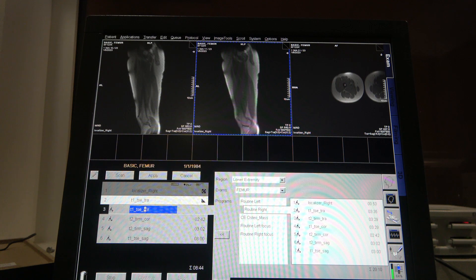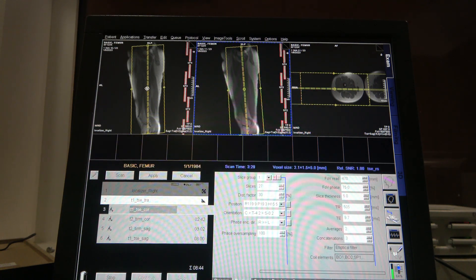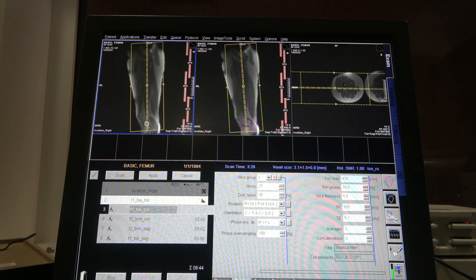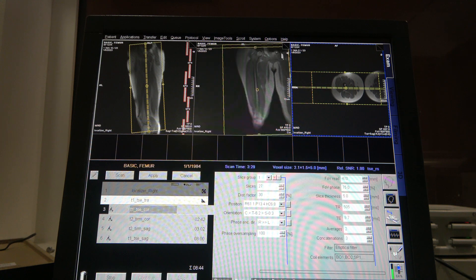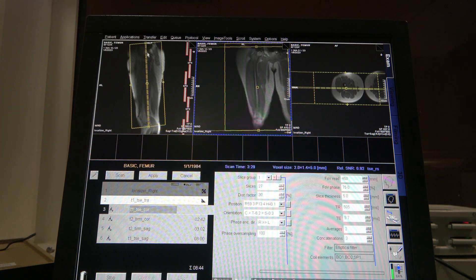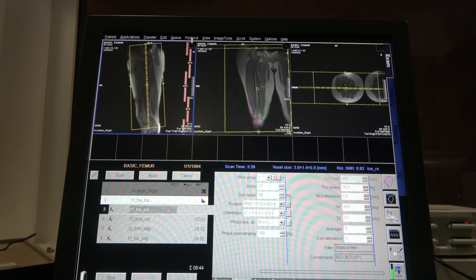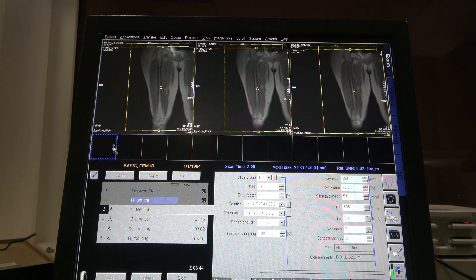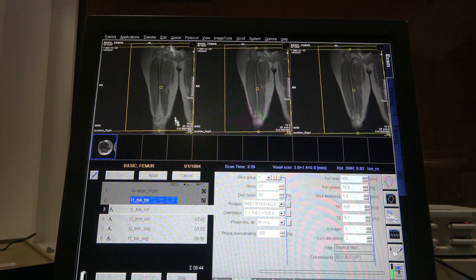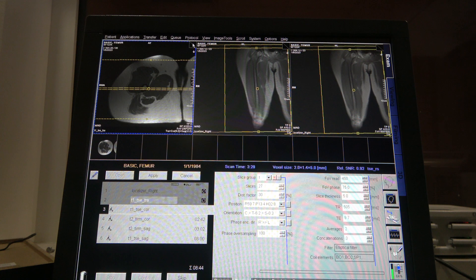Now let's set up a coronal. You can wait for an axial or you can just set it up. The goal is, once again, to make sure you get joint to joint and the muscles — that's the main goal. You really don't want to get all the extra tissue. So here we go: joint, joint. We can actually drop it down a little bit more. That's pretty good. So it didn't populate here, so let's throw it in this box and also here.